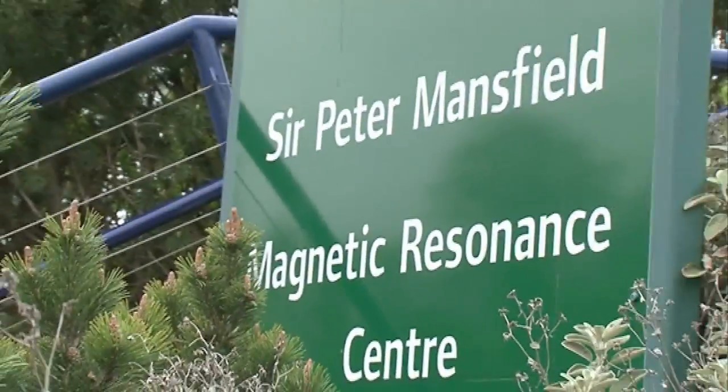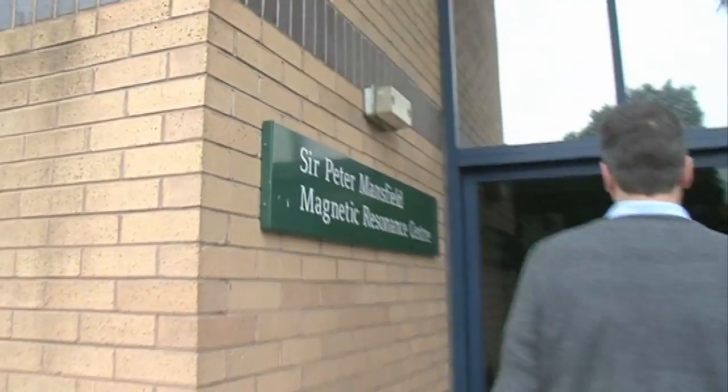Nottingham University is famous for having developed the technique of magnetic resonance imaging, so we thought that for Easter we'd have a go at taking an image using magnetic resonance of a cream egg.